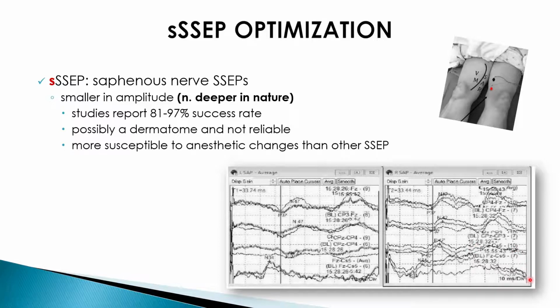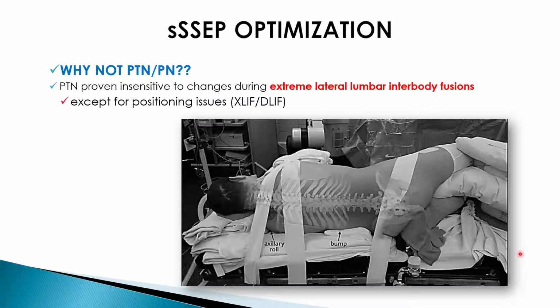Of course, you don't have a peripheral response or a response before the operative site. However, you can get good subcortical, and here's the cortical responses, left side and right side. As I said, we had pretty good luck with these.